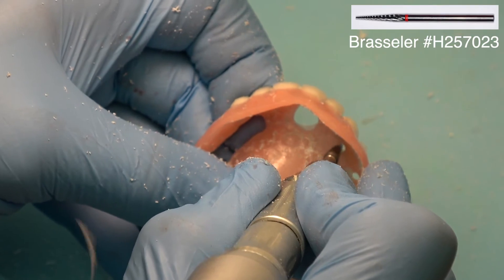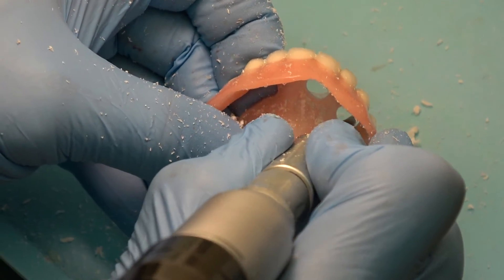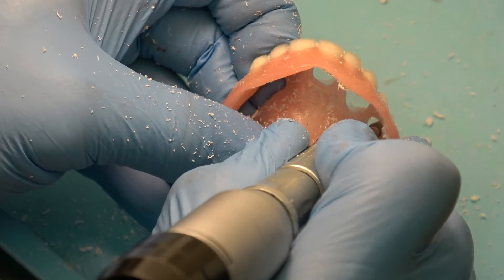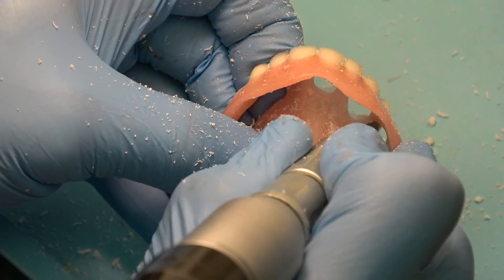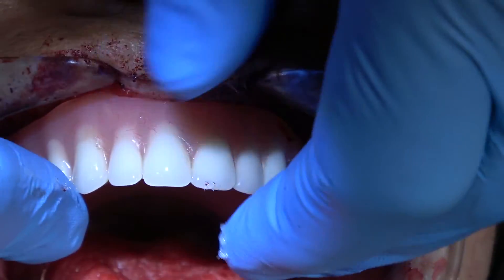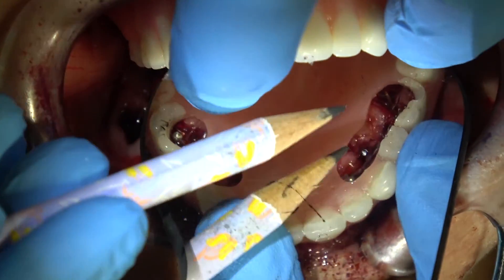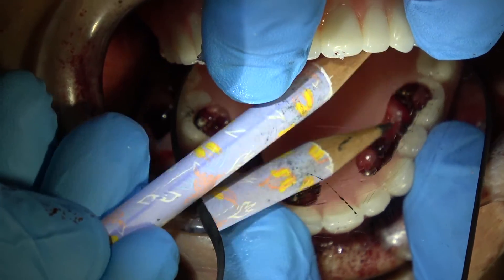Just push it to place, and it's going to be a little bit high because the implants are sticking out just a little bit. Then you're going to go to the lab, and just with a long shank round burr, you're going to cut holes in the denture through the holes that the implants made in the blue mousse, and then hollow those holes out some more.